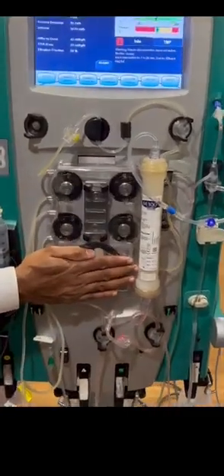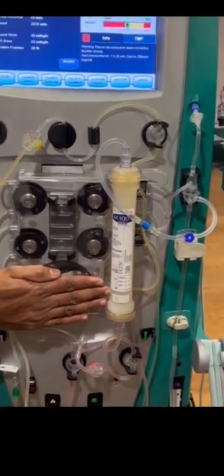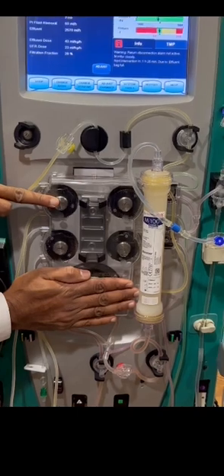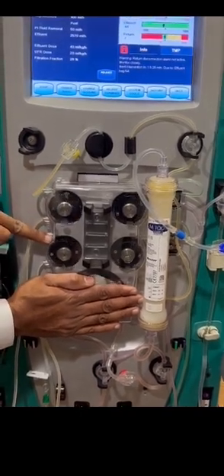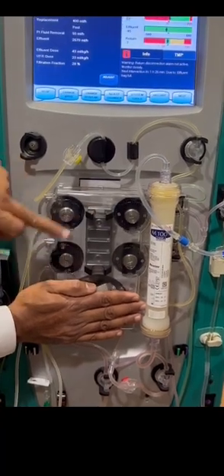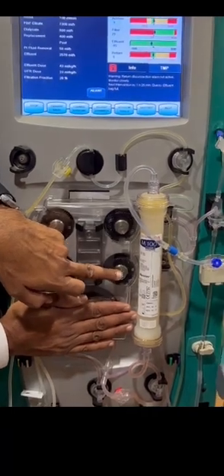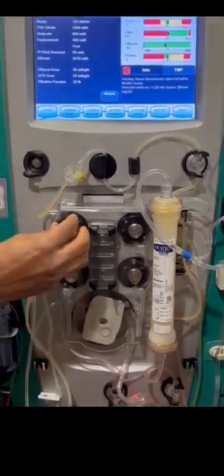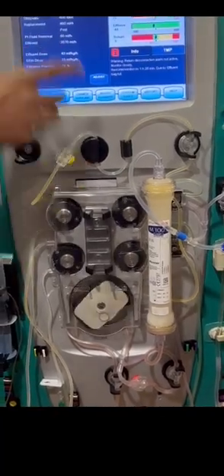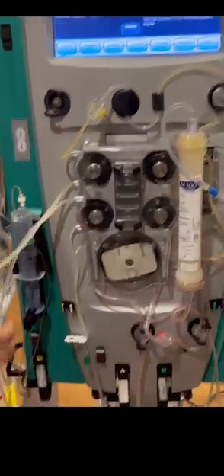This is the blood pump. Which pump has the highest speed? Blood pump. Next is the effluent pump, then pre-blood pump, then dialysate, then replacement. Because this pump's job is to remove 2570 ml of fluid from the circuit to the bag in an hour.